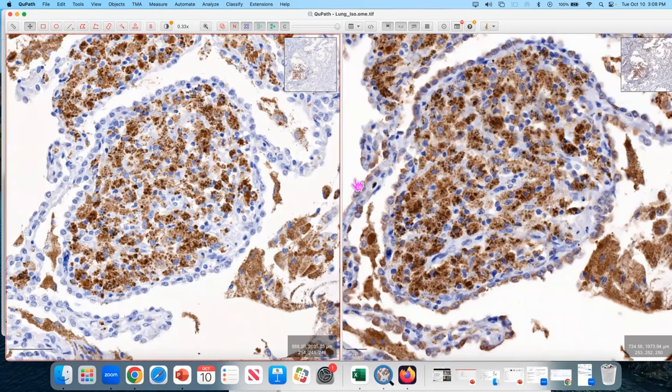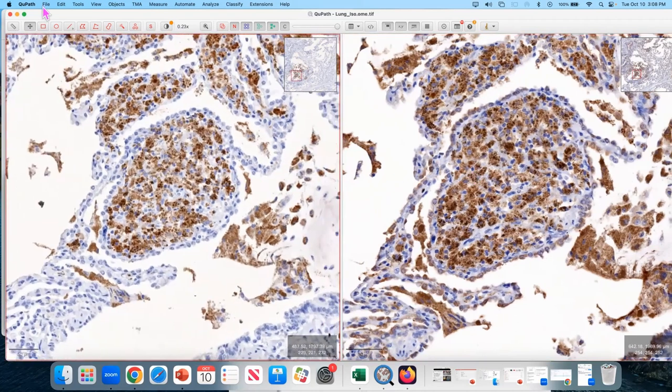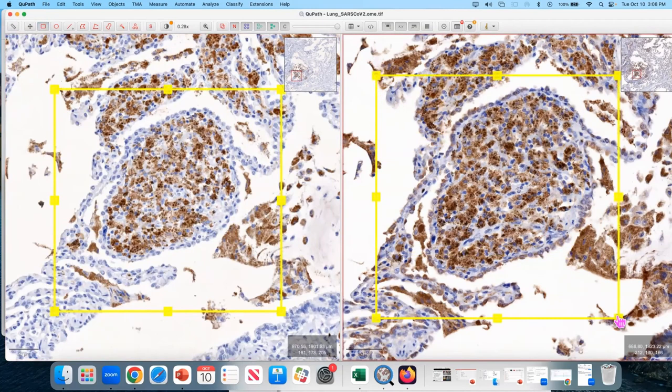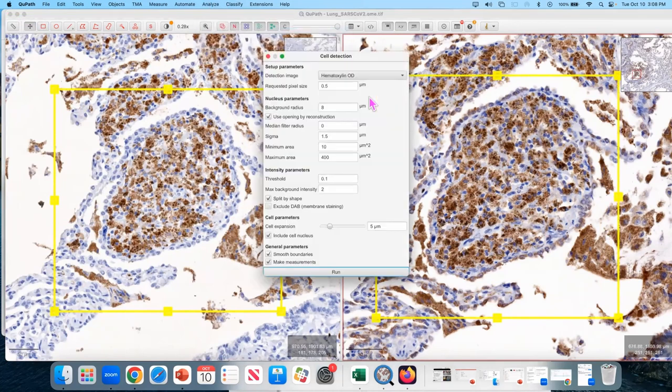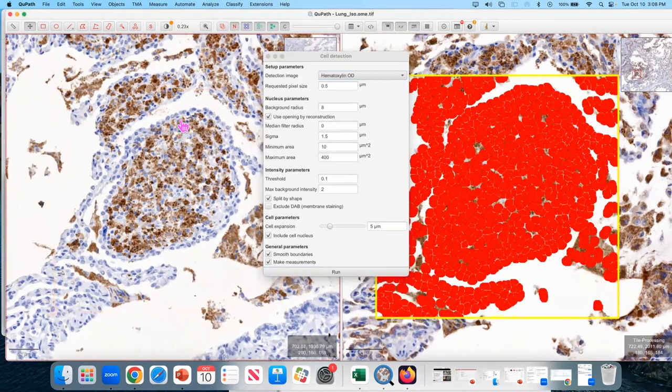So the right way to do it is to go through all of the previous steps that we've learned, estimate stain vectors, spend some time on doing the right cell detection. But in the interest of time, and to show you how amazing default settings in QuPath are, we're just gonna hit cell detection and just run it. Do the same on this one.